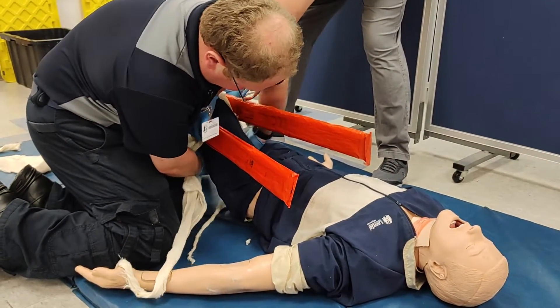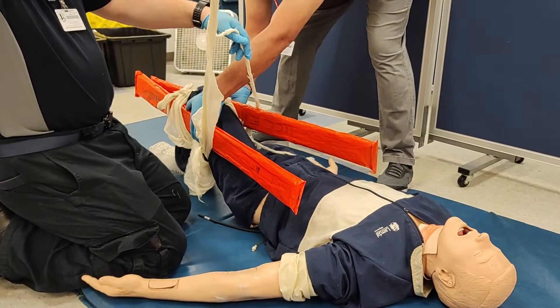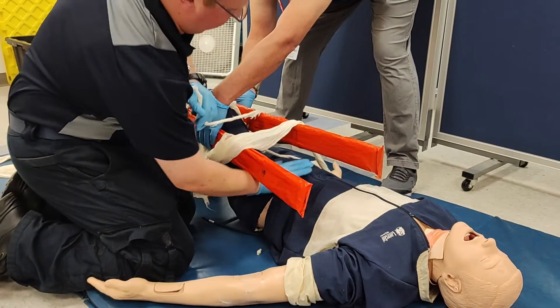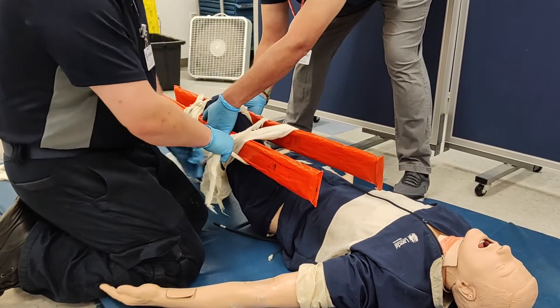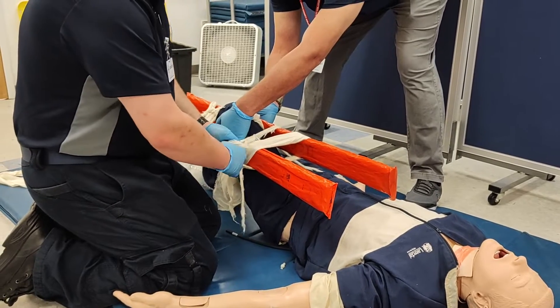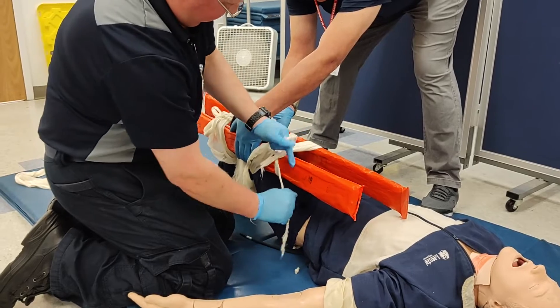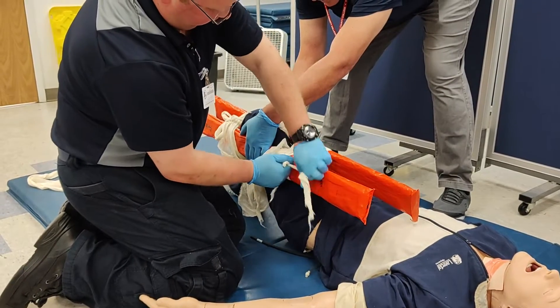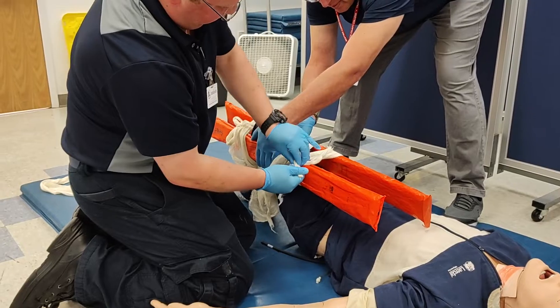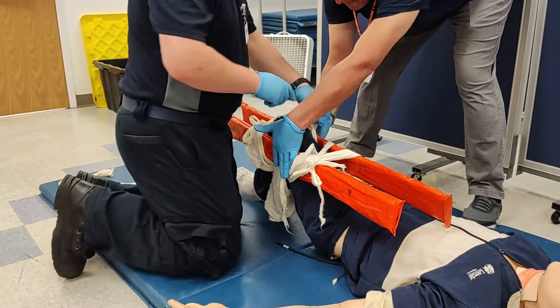The same process is applied above the knee, with the long end of the cravat being wrapped a second time around the splints. The excess slack of the splints is cinched up and pushed as close to the knee as possible to prevent later slipping. Notice how the knot is tied over the splints — as opposed to over the patient — for maximum tightness.